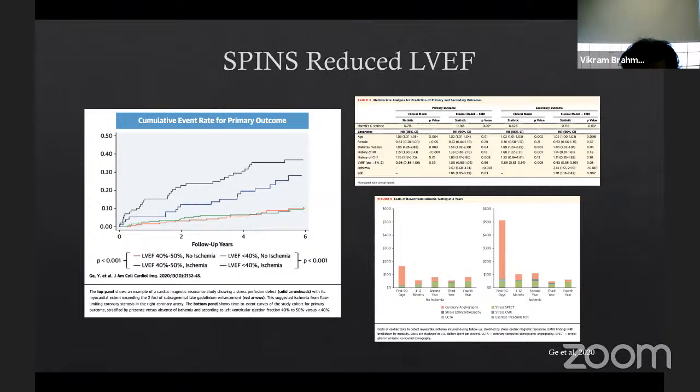And in this cohort, essentially the ischemic pattern for LGE was seen in 48% of folks, but a history of MI was only present in 24%. So again, something like SPECT would miss this. And even if we were thinking about echo, really if you're relying on regional wall motion and looking for changes with stress in the echo lab, it could be a non-specific finding. You could see regional wall motion abnormalities in non-ischemic cardiomyopathy. So it's not always as helpful. I think with MRI, there's not much of a debate with what you're looking at.